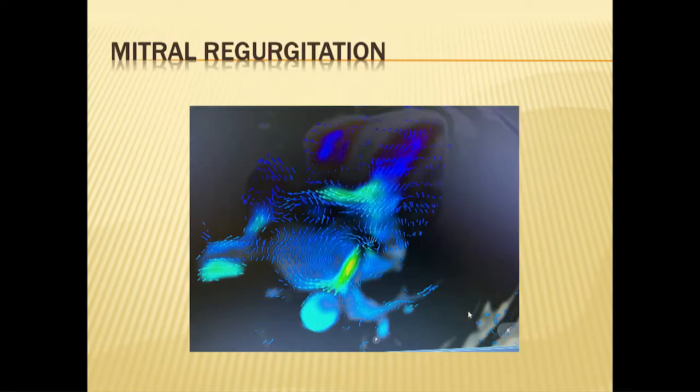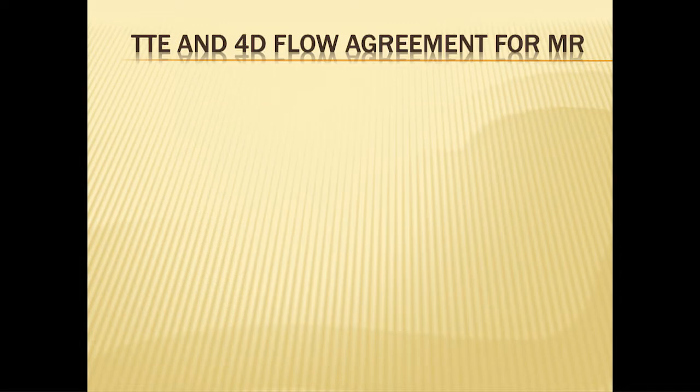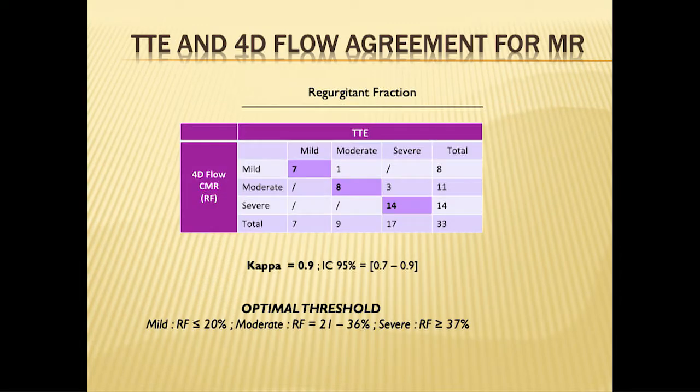Now we do the same job with mitral regurgitation. And also we did the same, and we changed the threshold with a little difference.